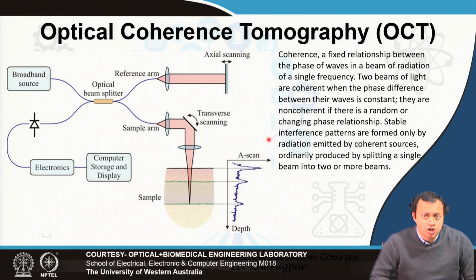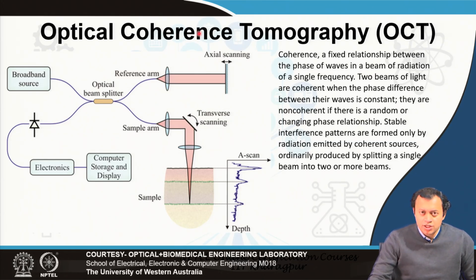This is a subsection of the same chapter where we were discussing NSOM versus OCT. OCT is a different method, it does not break the diffraction limit, we measure it somewhere in the micrometer range. So, optical coherence tomography is a new technique, a different technique than NSOM. It is used mostly for getting the depth profile of tissues. Okay.